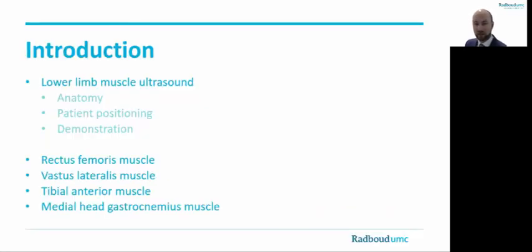We will discuss the rectus femoris, vastus lateralis, tibialis anterior, and the medial head of the gastrocnemius muscle. We will try to do that all in the same way — reviewing anatomy, patient positioning, and demonstration of the measurements.